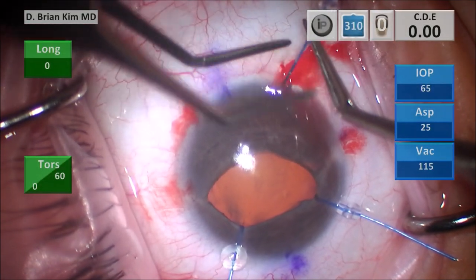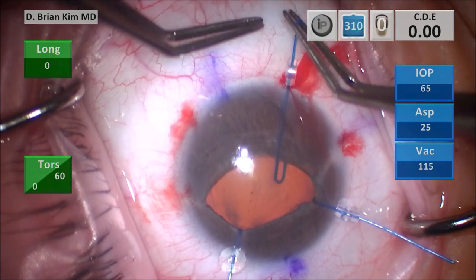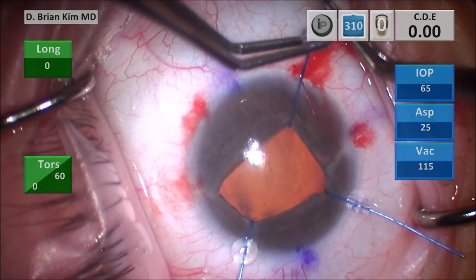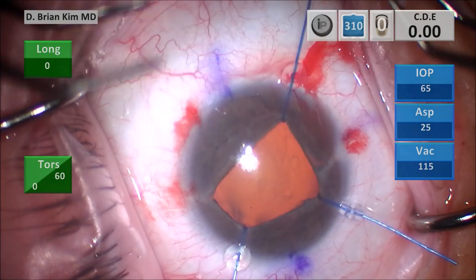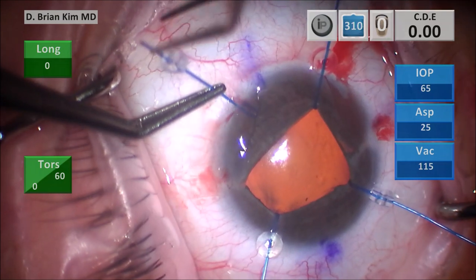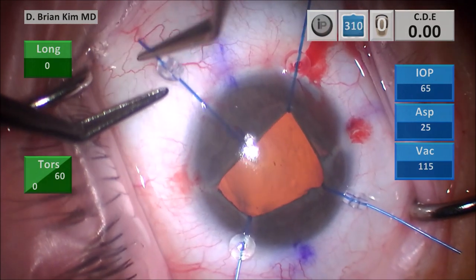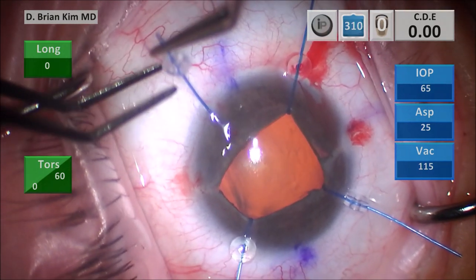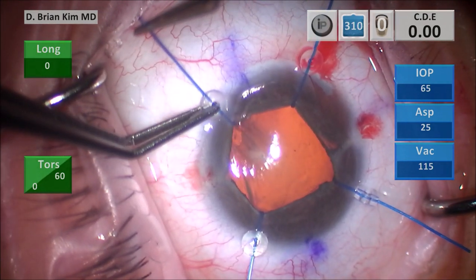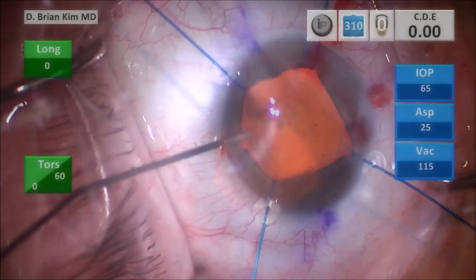I prefer iris hooks over rings in these situations because the irregularity is better to control with each separate hook, and you can pick the quadrants and the actual location where you want to place the hook to retract the iris. You're also providing support of the iris hook at the level of the sclera, whereas a ring is only being supported within the iris itself.